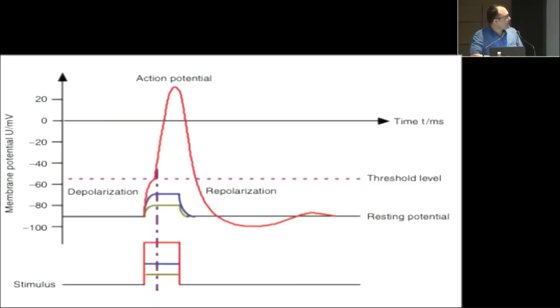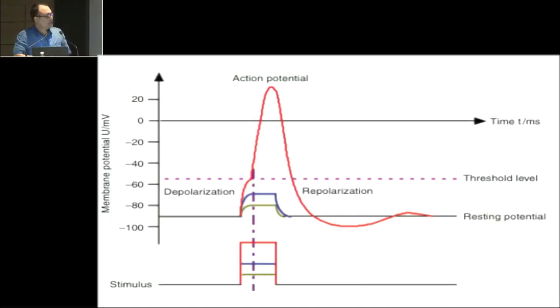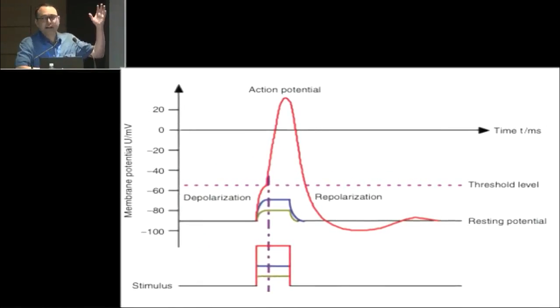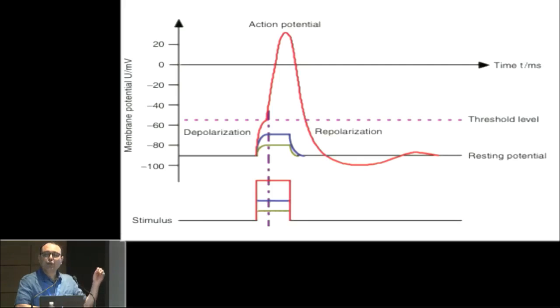Once a threshold level of around minus 55 or 50 is reached, there is a constant firing of action potential through this nerve, which will cause effective muscle contraction. That will get the twitches like this. And there should be a stimulus, and that stimulus we are giving by a peripheral nerve stimulator.